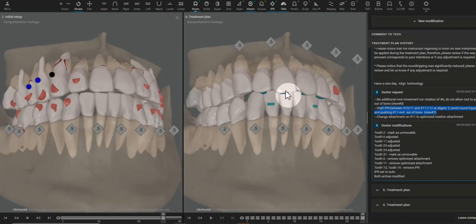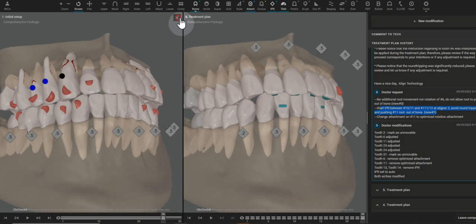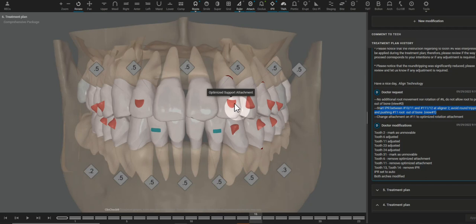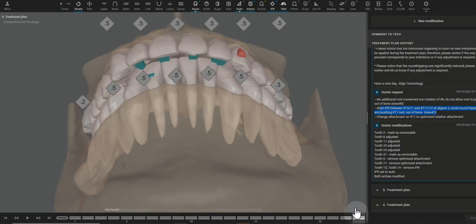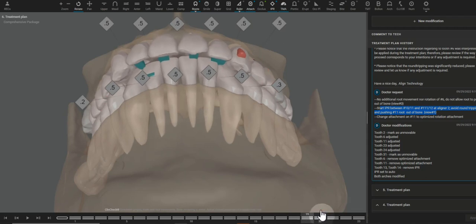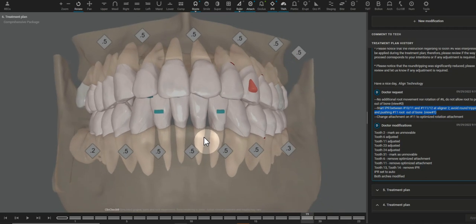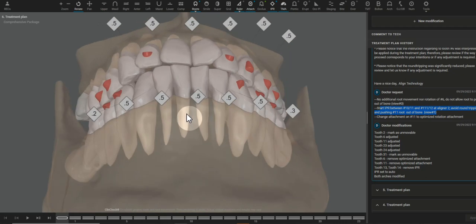Utilizing bite ramps, as always, to prevent the molars from passively intruding throughout treatment. My most favorite attachments — the optimized lateral support attachments — those keep a good anterior grip and that will help the central incisor rotation be more predictable. And then we're over-treating some of the more difficult rotations here, so adding those extra aligners at the finish. Let me know if you have any other questions. Otherwise, this crowding case is ready to go.